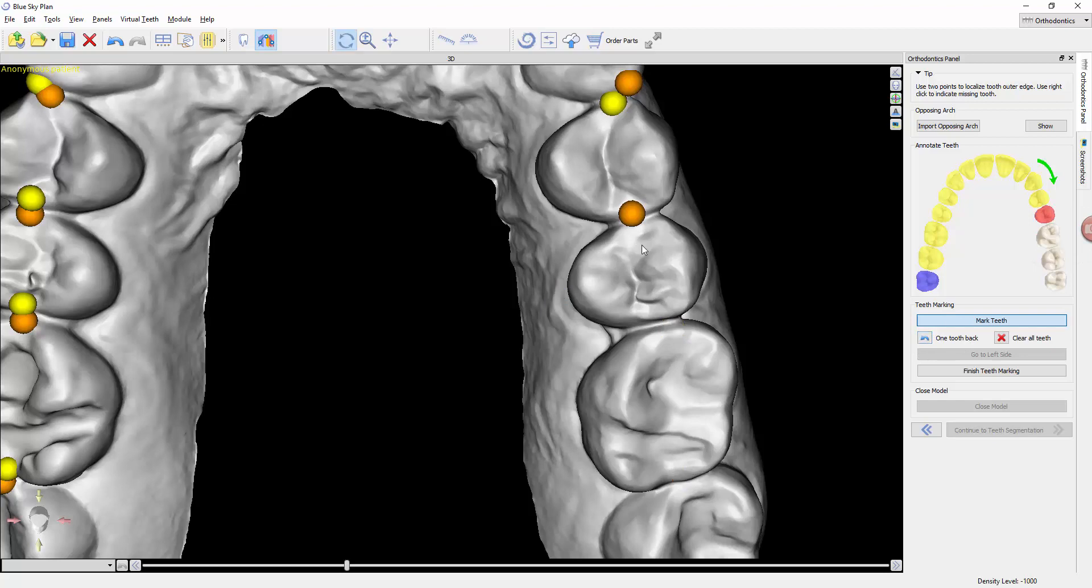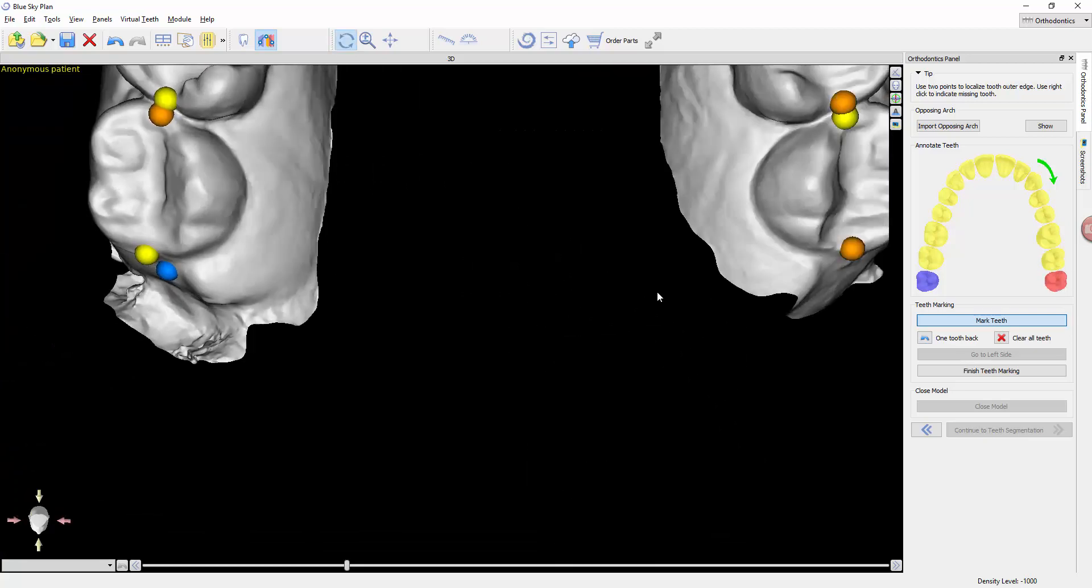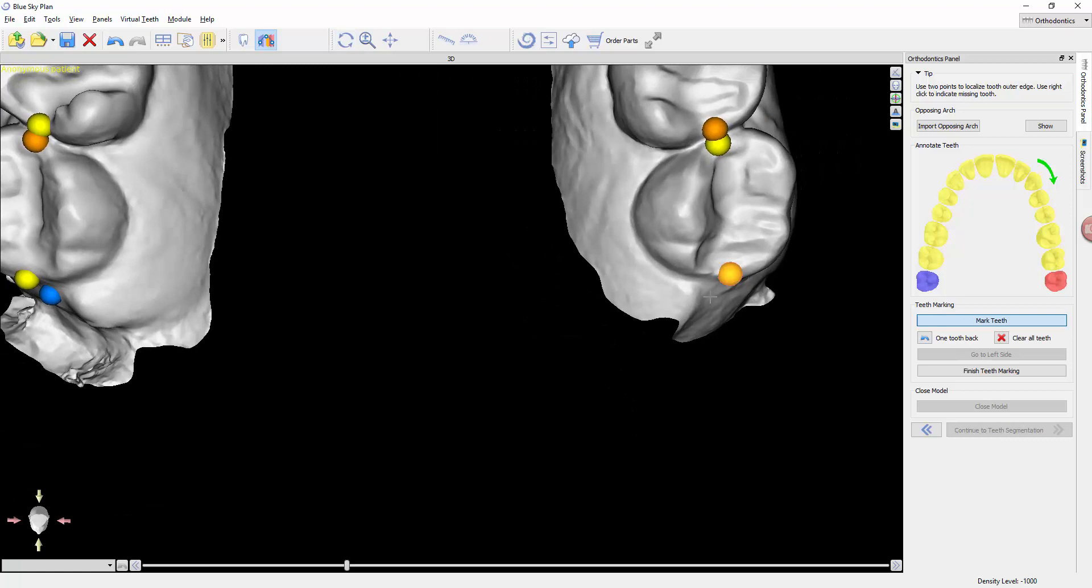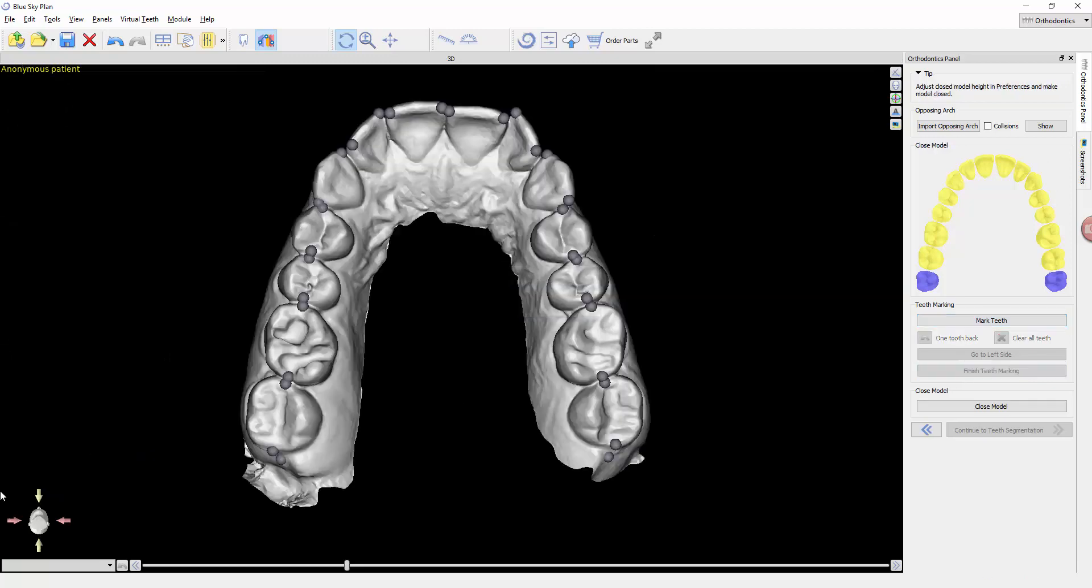Now since we have it, I am going to go ahead and click the teeth. There's really no need to mark the wisdom tooth because it's going to ignore it anyways, but just to go ahead and finish that up. Now I click on finish marking teeth.